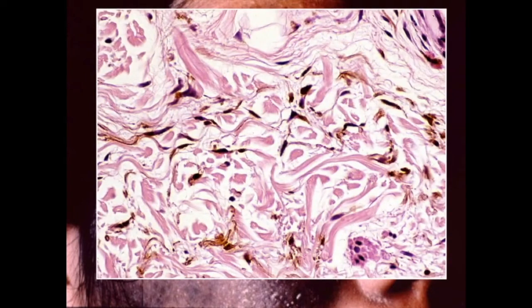Nevus of Ota is a blue nevus. It does not give rise to skin melanomas. And the major problem with nevus of Ota is the propensity for patients to develop uveal melanomas. This is a blue nevus. We see dendritiform melanocytes in the dermal tissues, a variant of blue nevus. This is an example of a cellular blue nevus. I've seen several cases of this during my career. All of the patients have died from CNS melanomas.